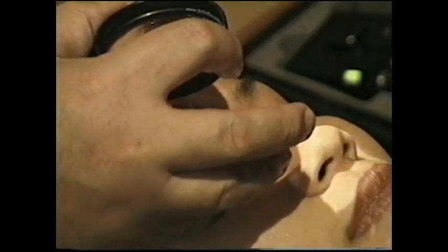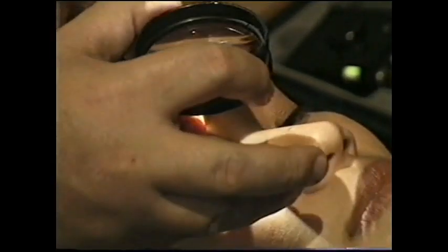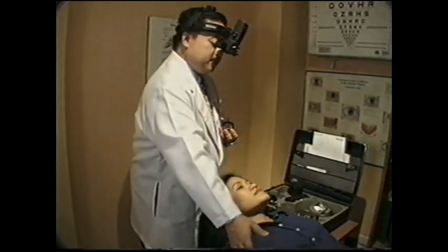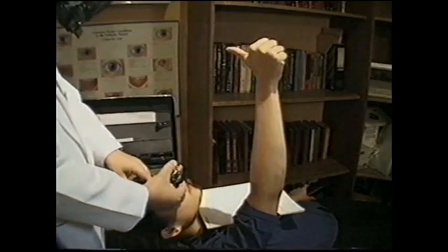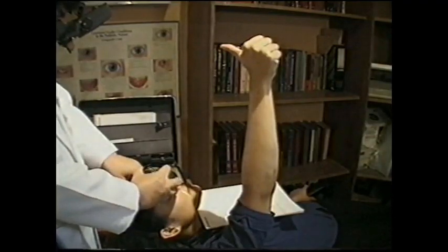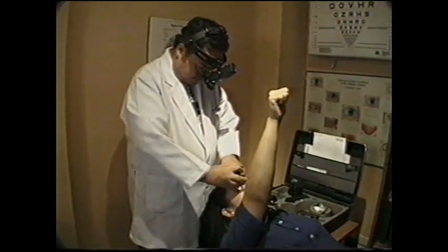Ask the reclining, fully dilated patient to gaze steadily at a distant target on the ceiling. Patients with poor vision are asked to extend an arm and stare at their outstretched thumb. While standing above the patient, direct the headset's light by tilting your head so that it illuminates the fundus when focused through the condensing lens.